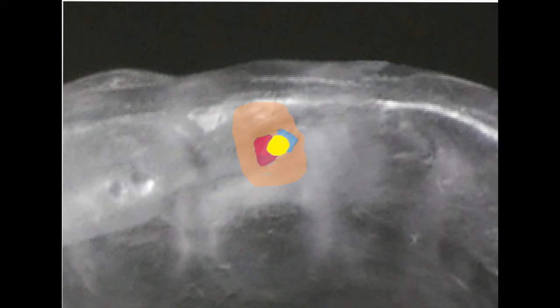The blue and red areas are where you may need to adjust the perimeter wall of the fossa as we achieve centric relation. But remember, never, ever deeper than the yellow part. The goal is flat with the plane of occlusion. The orange area is also adjusted to almost flat so that it is never in contact during any excursive movement.